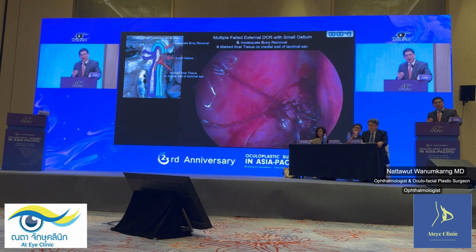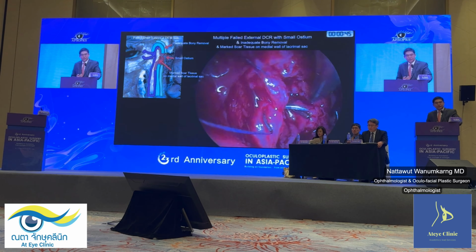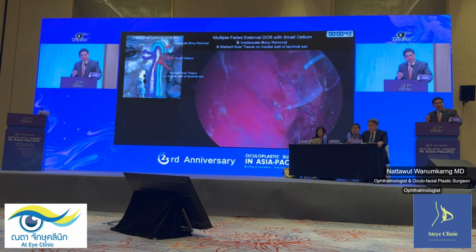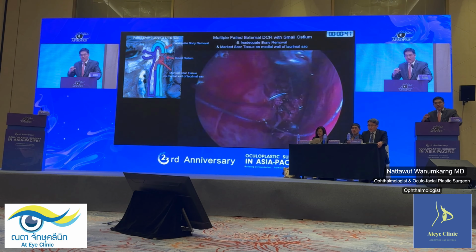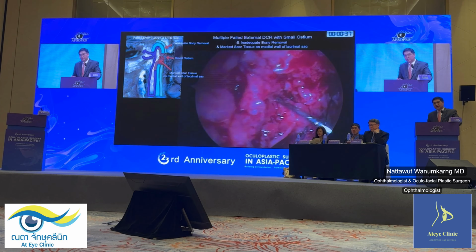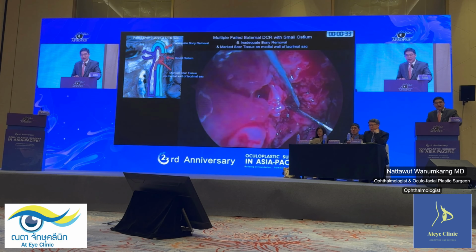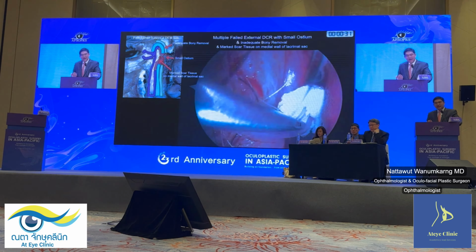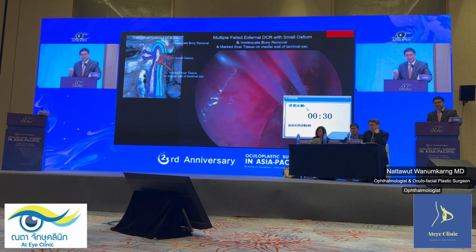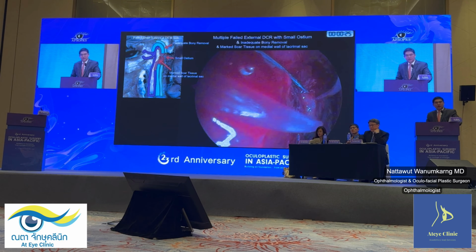So we thought, why don't we suture the flap inside the nose with two sutures? This can be done thoughtfully to make the approximation of the lacrimal mucosa and the nasal mucosa forcefully. And if you can open that, you do everything: you put the silicone stent, you put the gel foam, you put the Kenacort, or sometimes put the MMC.